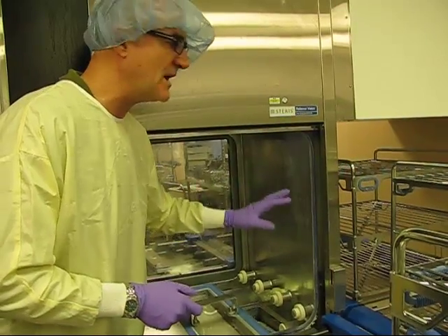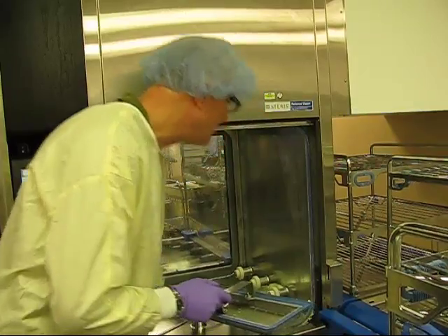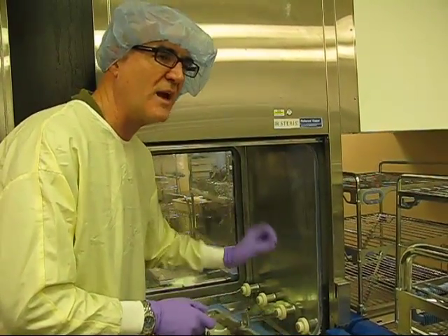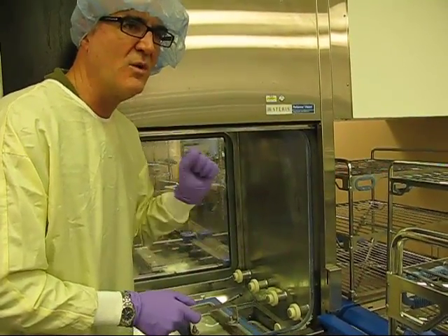There's many different types of washers. Each one is different on where the screen's located or the type of spray arm, but you need to check and do that on a regular basis, minimum daily, preferably every shift, or when you see it's plugged up. So again, this allows you to do a check sheet to provide this information, so if there is something, you can go back and work with the preventive maintenance people or your biotech or whoever is fixing the machines, and you can get it running optimally.